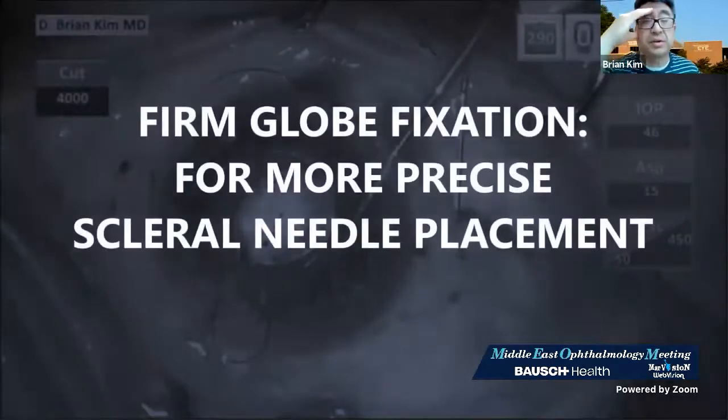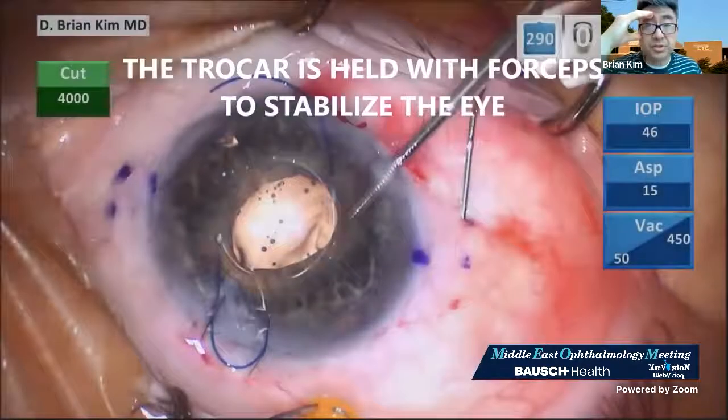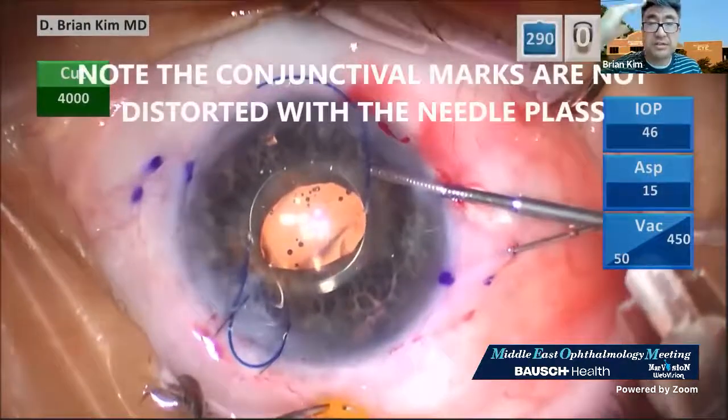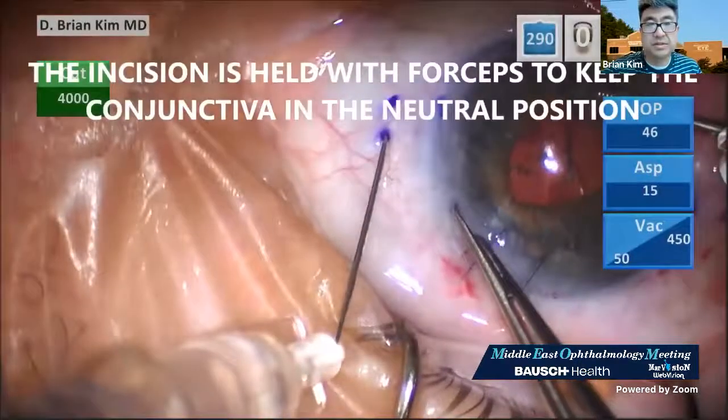And this is just a video illustrating my point. So the trocar is held with forceps to stabilize the eye. And you can see that the conjunctival marks are not being distorted with the needle pass.